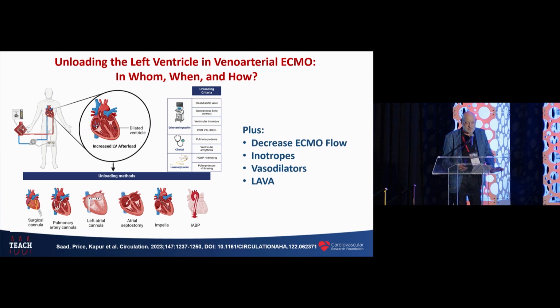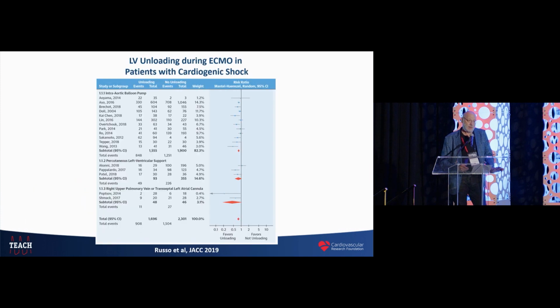Now, of all of these approaches, really, the Impella and balloon pump are the most common, at least mechanical approaches, to achieve venting. And the question is, do these provide any benefit, and is one better than the other?